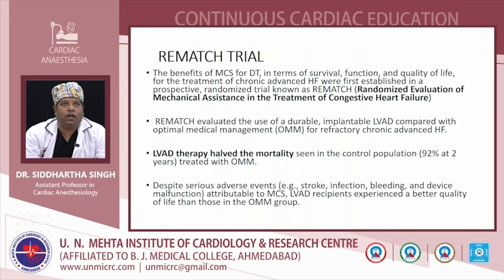There is the REMATCH trial, the Randomized Evaluation of Mechanical Assistance for the Treatment of Congestive Heart Failure. REMATCH evaluated the use of a durable implantable LVAD compared with optimal medical management for refractory chronic advanced heart failure.